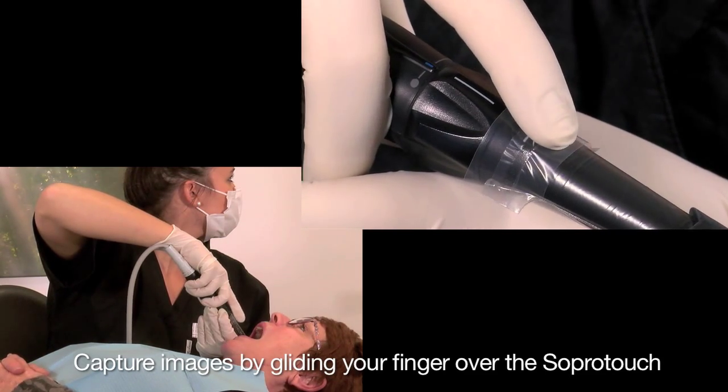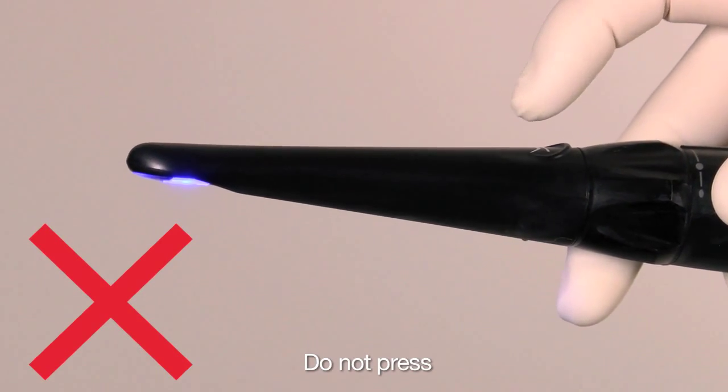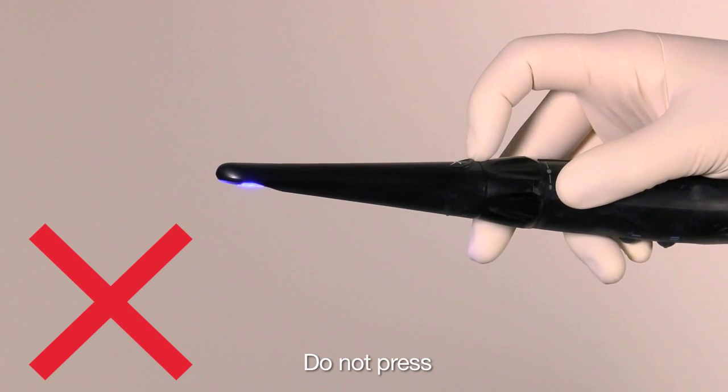Hold the camera handpiece steady when you touch the SOPRO touch. No need to push or press the camera handpiece to capture the image or video.